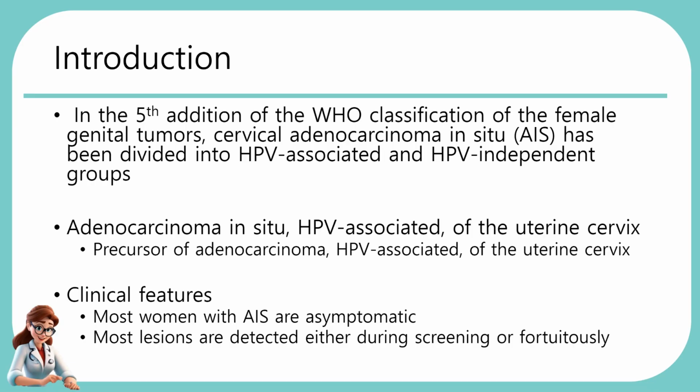Today I'm going to be talking about the microscopic features of cervical adenocarcinoma in situ. Before we look at the actual case, let me give you a brief explanation on the adenocarcinoma in situ, aka AIS, of the uterine cervix.